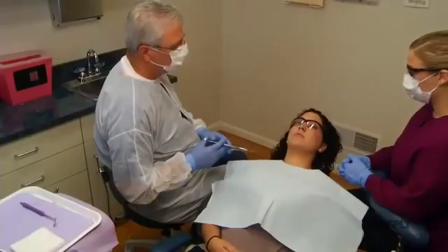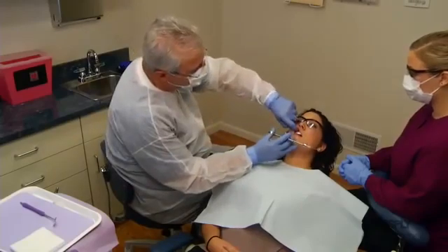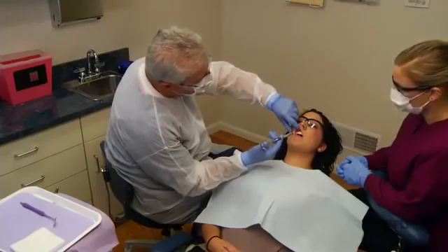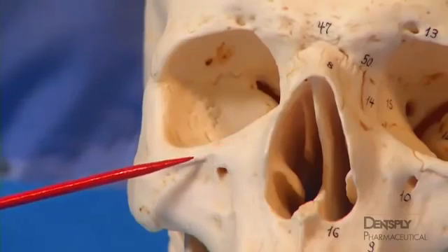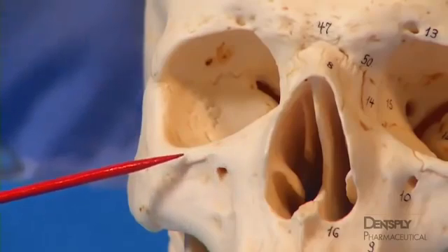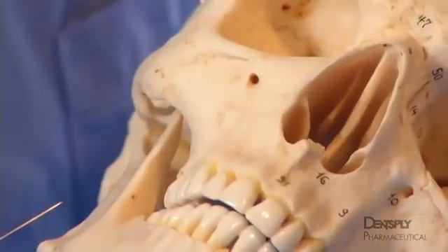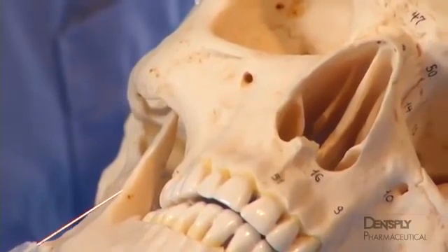Because of crossover fibers from the contralateral side, anesthesia of the central incisor may be incomplete unless a supraperiosteal injection is made over that tooth. An important advantage of this vertical approach is that the overhang of the infraorbital rim protects the eye from accidental needle puncture. Correct orientation of the needle bevel during insertion offers two potential advantages.